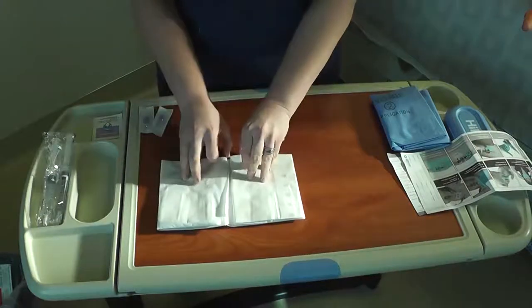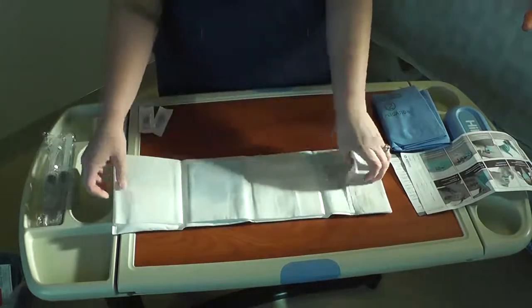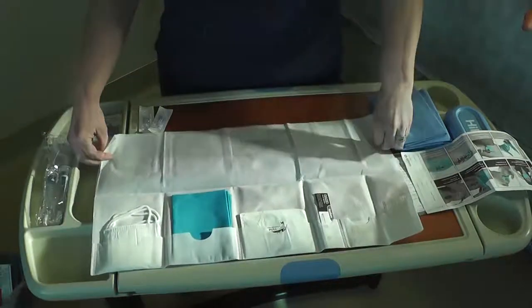Open Step 1 out lengthwise on a clean bedside table. All the supplies are sectioned off in pockets and, like reading a book, you'll start from left to right.